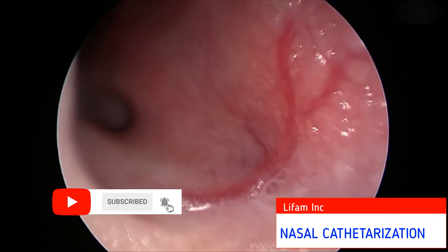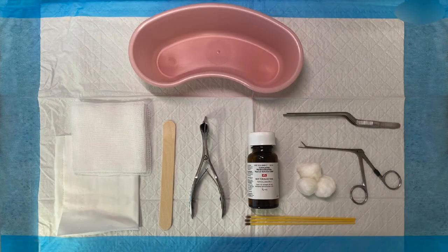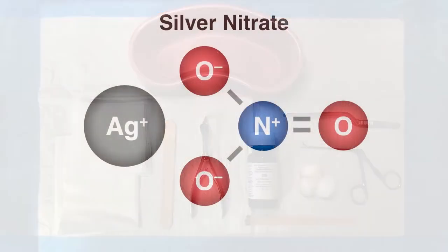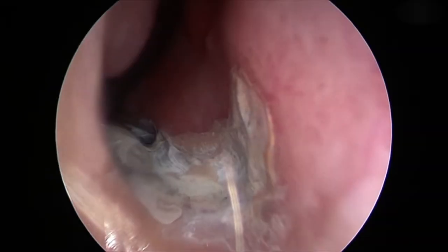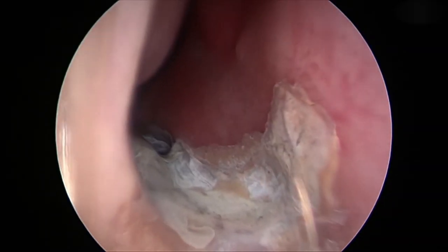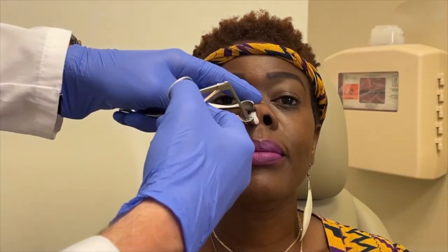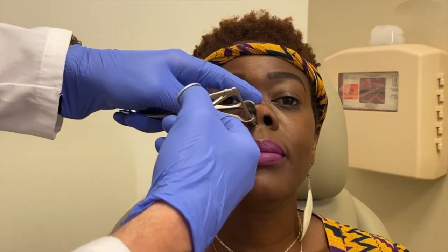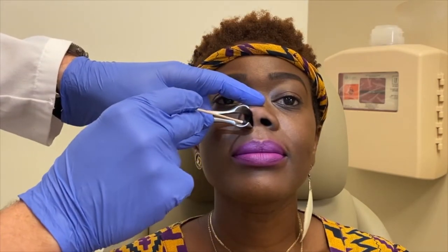Nasal cauterization with topical silver nitrate is a common and reliable intervention for the treatment of recurrent or active epistaxis. The release of silver ions forms an eschar that obstructs and scleroses blood vessels. This video demonstrates the evaluation of a patient with recurrent epistaxis and the technique for performing nasal cauterization with silver nitrate in the office.